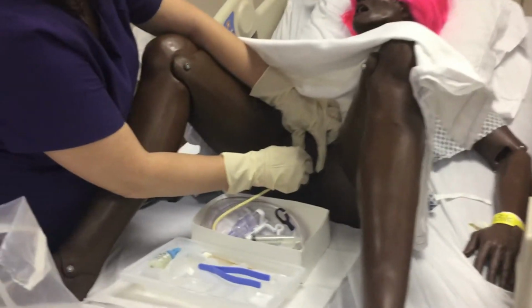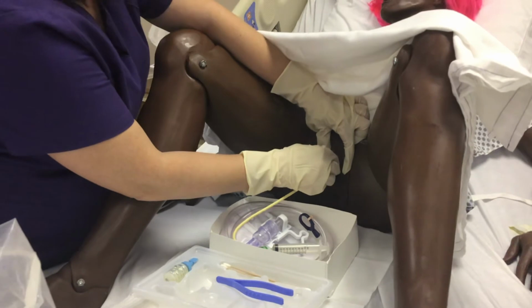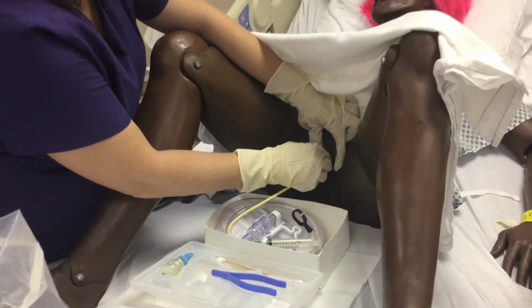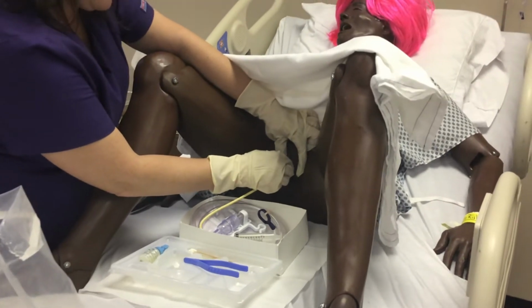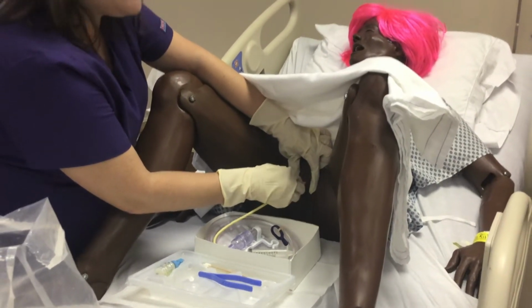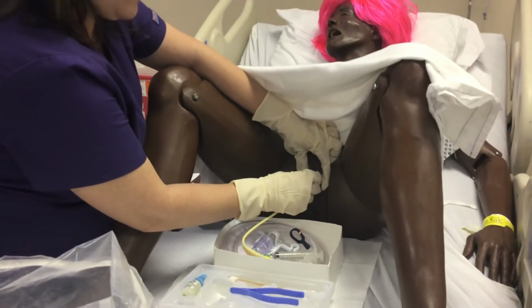And now I'm looking, and I do see there is urine in the tubing. So I am in the bladder. It is clear, and it is yellow. It's not cloudy. So now, since I've seen that urine, I'm going to push in another inch or two, okay?